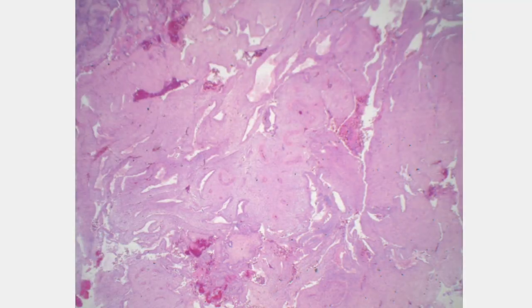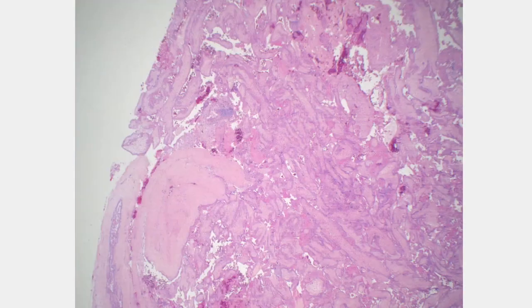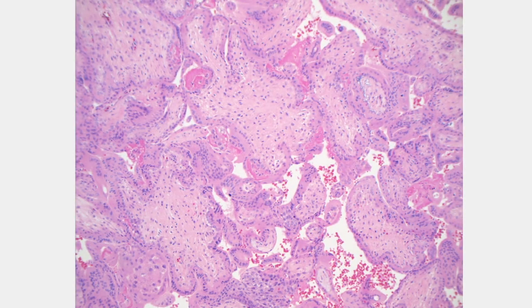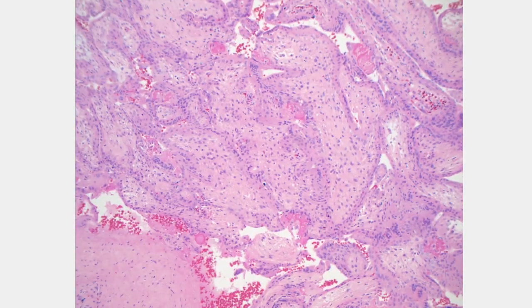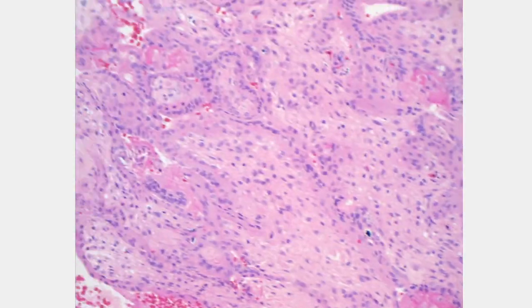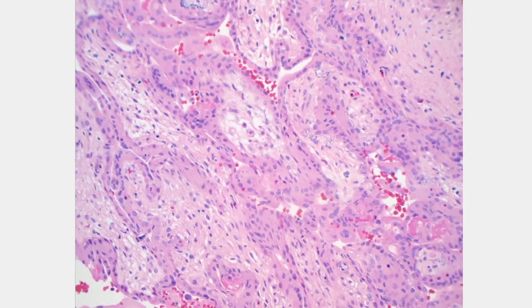Now let's show some involutional changes. That's when the POC is retained in utero. So let's see what we're going to see here. One of the difficulties is that when the POC is retained in utero, the first thing that closes up are the vessels. So when we look at this case of a missed abortion, we see that a lot of the villi do not have open vessels.